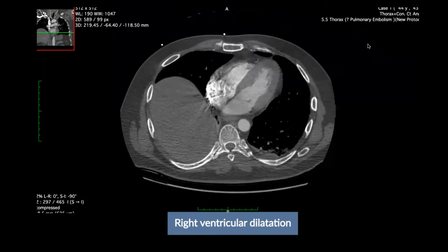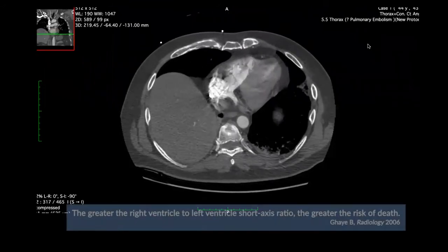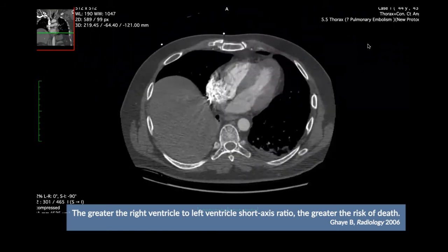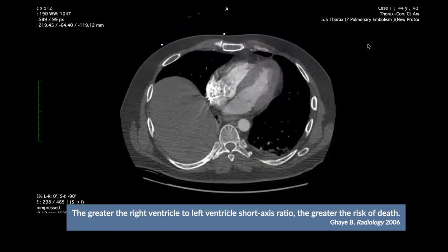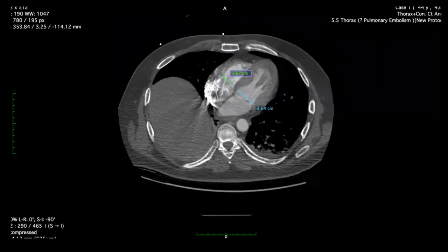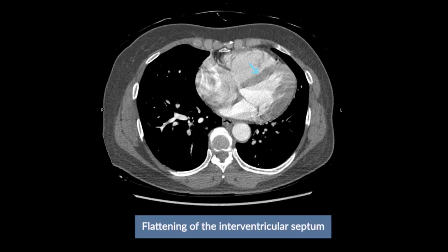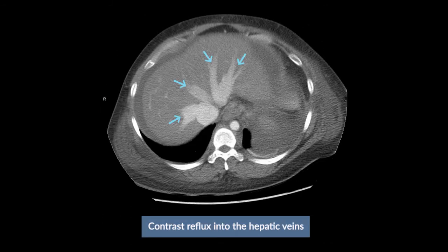Firstly, the presence of right ventricular dilatation can be diagnosed if the short axis of the right ventricle is wider than that of the left ventricle. We obtain the short axis measurement of the right and left ventricle, and this is not present in this case. Other findings of right ventricular strain or failure include flattening or deviation of the interventricular septum towards the left ventricle, or contrast material reflux into the hepatic veins.